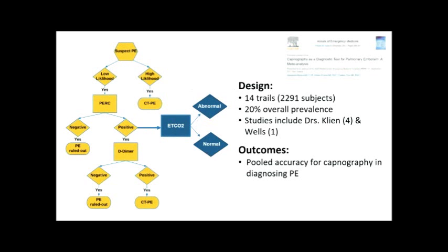There were some challenges in this, in that the literature has different ways of describing the capnographic values. So as we talked about, are you using an end-tidal reading? Are you using an alveolar dead space fraction? So there are heterogeneous definitions. But what they were able to find is that overall, using end-tidal CO2, we have a sensitivity of 80% and a specificity of 49-50%.